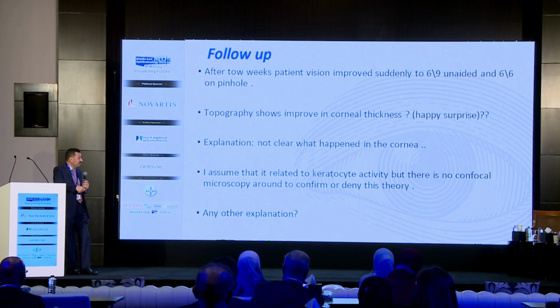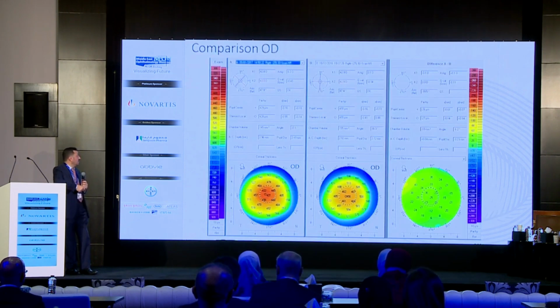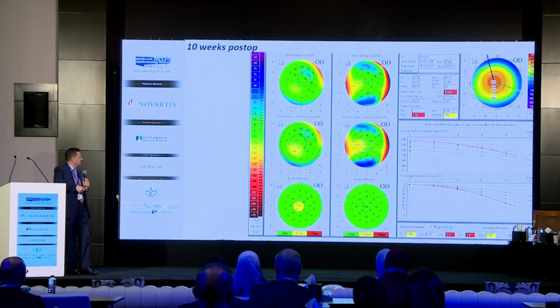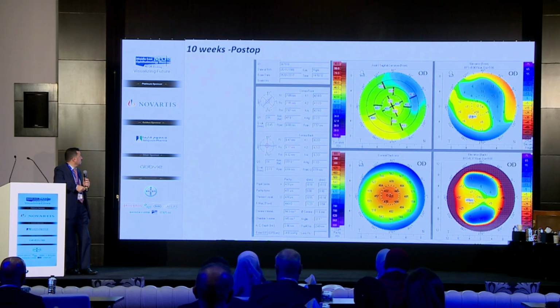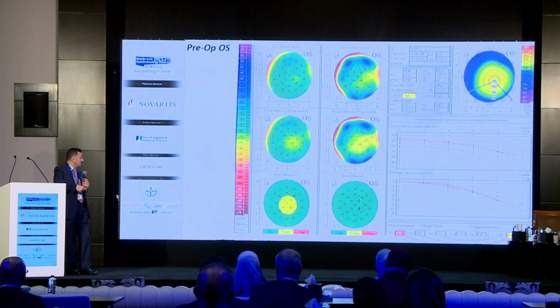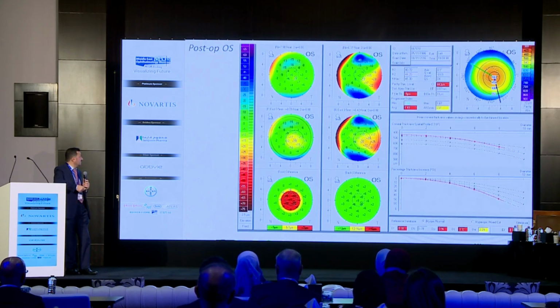Do you have, for the other colleagues, Professor Hosni, Dr. Ashraf, any other explanation? Yeah, can we return to the photos again, pre and post? Because there is much improvement in the anterior curvature in the right eye compared to the previous, after the treatment. This is the pre. The before, yes, before treatment, you gave a very nice picture. This is the pre-op. No, before, when you saw the case, you did a Pentacam. Yes, before this, yes, and the right eye.